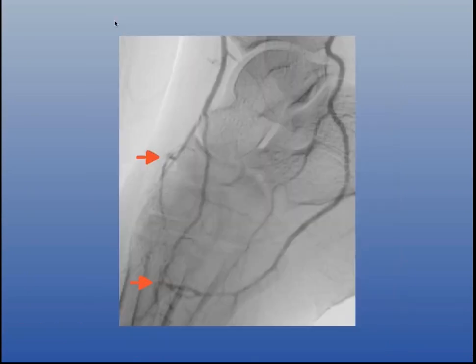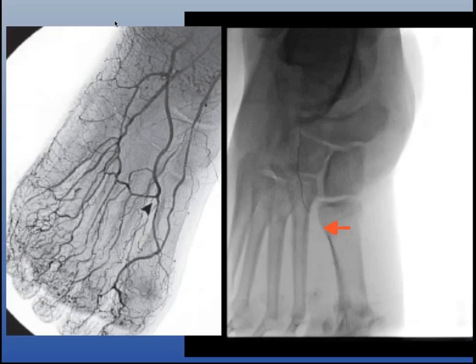And here's a small example of that. If you look at this, this is a CLI patient with ulceration and the distribution of a distal DP and proximal perforating artery occlusion. Basically, here's that diagram, and here's that recanalization I was showing you. So let me show you what that recanalization actually looked like from start to finish.